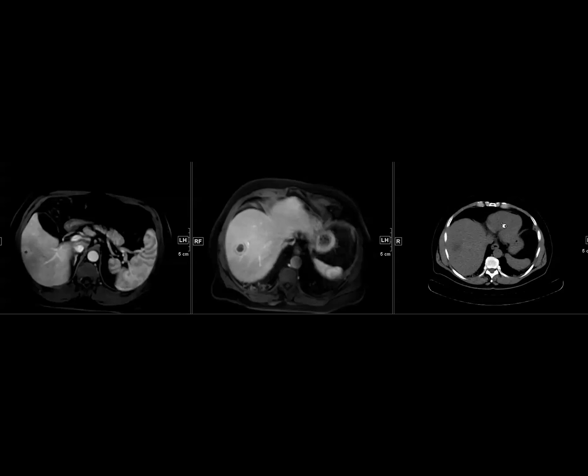So I don't know what they're going to do. They probably will do resection to get the diagnosis. There was nothing else anywhere in the body on PET or on CT. Anyway, so this is an irritating case of the day.